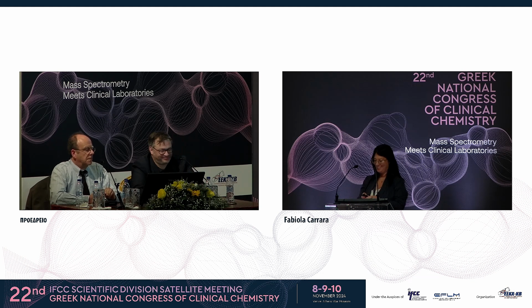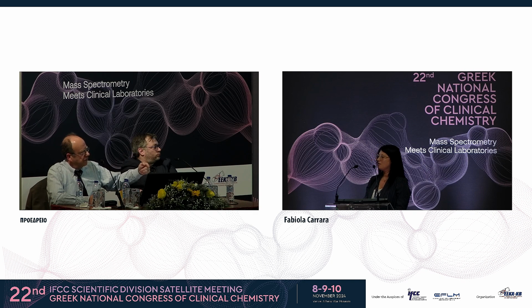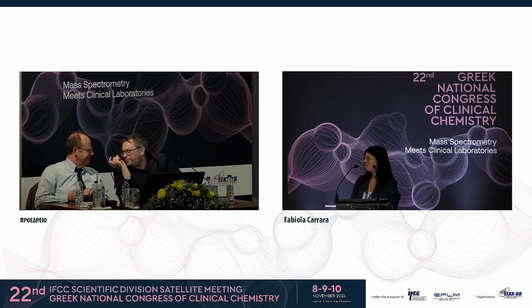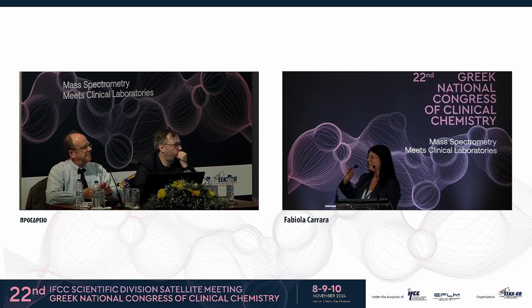Thank you. Okay. And also, it is important that you see the balance there. It is required to weigh the syringe that contains the iohexol before administration and after, in order to determine exactly the administered dose. In our center our nurses do not weigh the syringe because it's graduated, and if a nurse is well trained, the most important part of the pre-analytical phase is the nurse, because we can do nothing if the nurse is not able to perform the procedure.